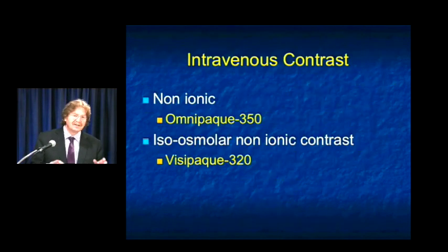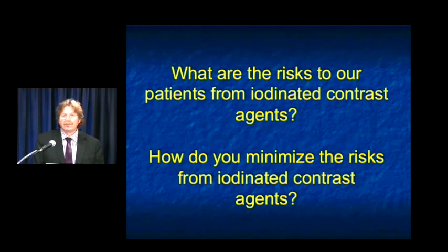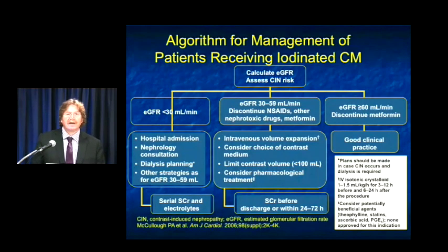Now the next thing is, you got the line in place, you have to choose a contrast agent, okay? And contrast selection is critical. There are many different contrast agents. I'll just tell you what we do at Hopkins, and we've done since I started here a long time, more than 30 years ago, a long time ago. We use either Omnipaque 350 or Visipaque 320. That's it, okay? We are concerned and always have been concerned and will be concerned about the risks to our patients from contrast agents, and we want to minimize the risks.